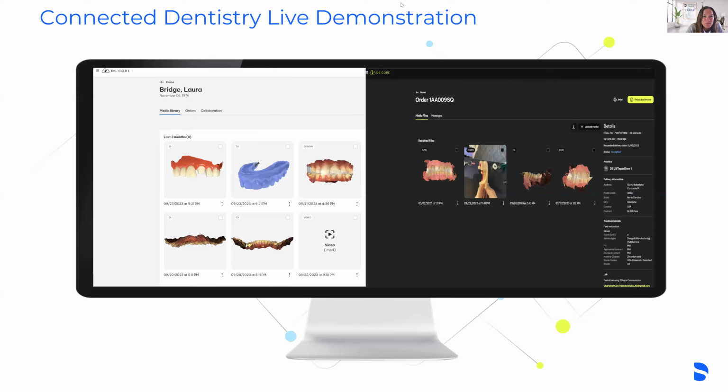Alyssa, do we have any questions that have come in as of yet? Okay. All right. I don't know, Karen or Yolanda, if there's anything you wanted to add with your experience with DS Core or Prime Scan.